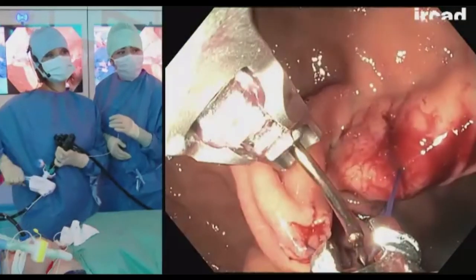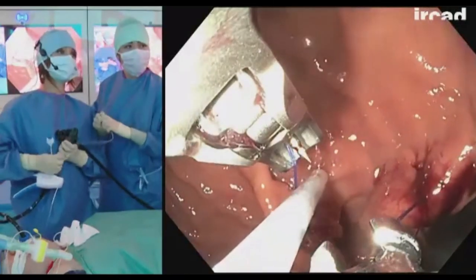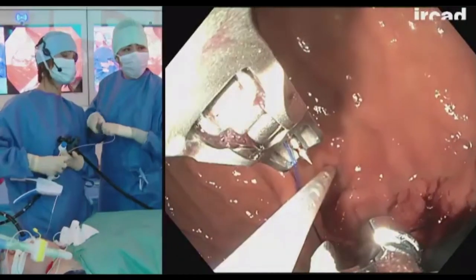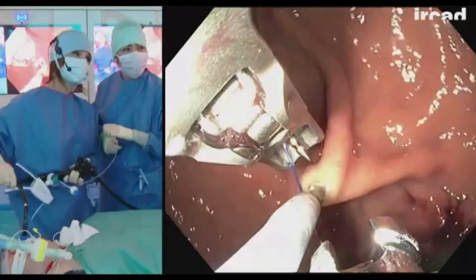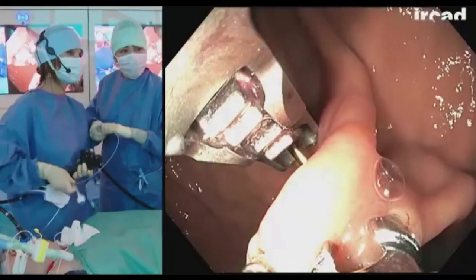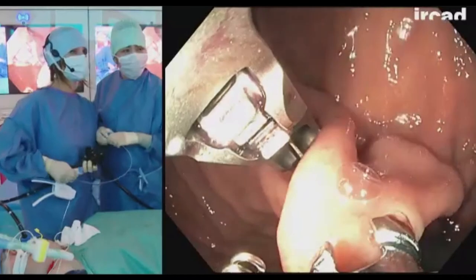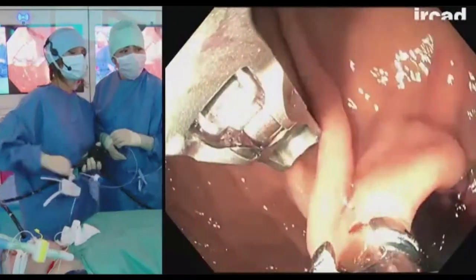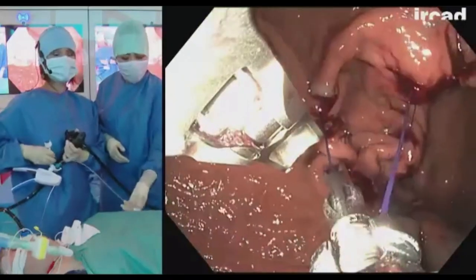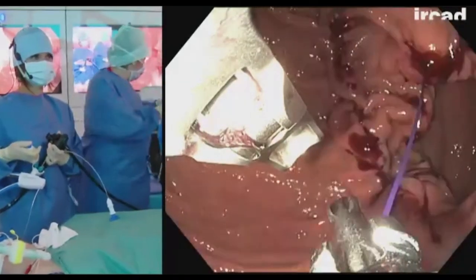Okay, so we're gonna reload and place our last stitch exactly at the same height. One, two, three. All right, so you see that Rita stops when the tissue is starting to rotate around the helix device. And that means that you have to stop because you're actually crossing the gastric wall. So I'm gonna release now my suture just by applying pressure and pushing on this blue button like this.